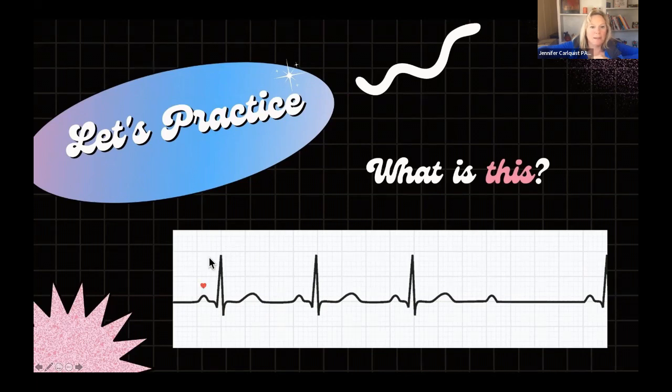We've got a P, an R, P, R, P, R, P, no R. But when the mom and the dad are together, they're together at the same interval. But occasionally a dad drops out for a second. So that's a second degree type 2. And again, why our family really matters so much. Okay, good job, Vanessa and Chris, everybody who said on Zoom, good job.